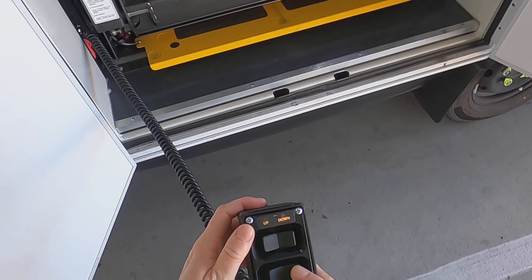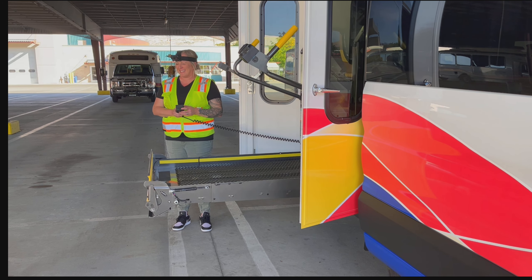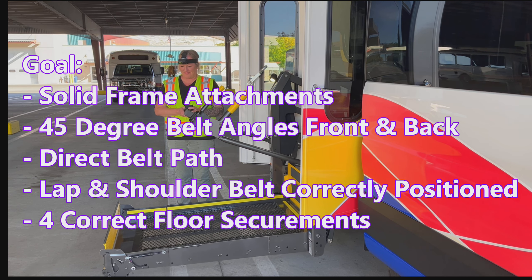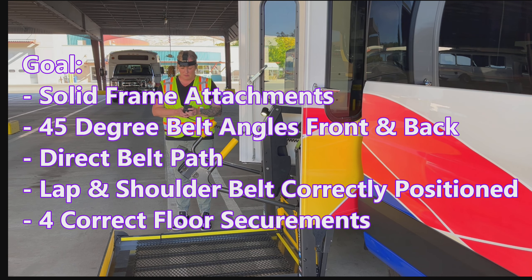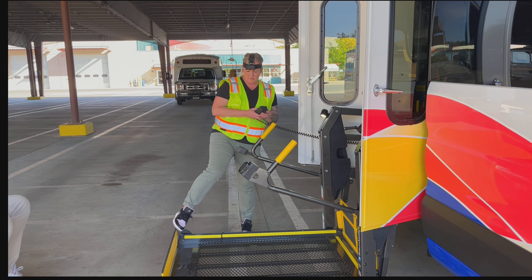First, I'm going to open the lift door and push unfold on the controller, then down. My goal is solid frame attachments, 45-degree belt angles for the front and back, direct belt path, lap and shoulder belt correctly positioned, for correct floor securements. Sometimes you have to step on the lift to get the guard to lay down flat.